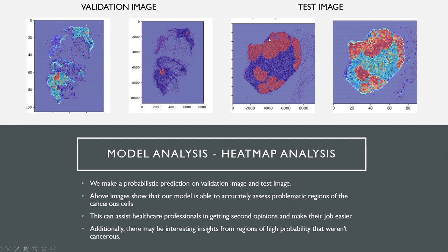This is the ground truth, right? We overlay the mask on top of the cancer patches to see where the cancerous areas are, and it looks almost identical, which is very positive.